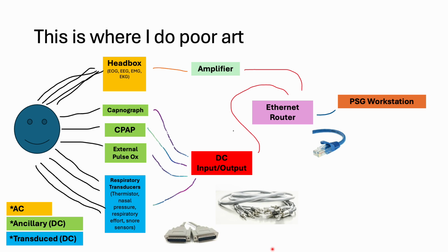These devices figure out the values we want themselves, and that data is transmitted to the DC box, which has sockets for inputs and sockets for outputs. The inputs are generally small headphone jack-looking wires, and the output is usually an Ethernet cable.